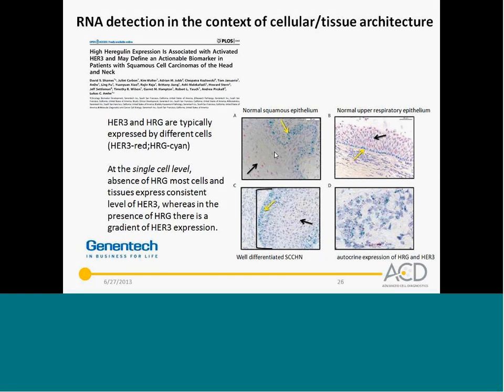of transcripts, something that you will not get by using high throughput analysis like RT-PCR or NGS, where you break cells up and collect a total count. Next slide, please.